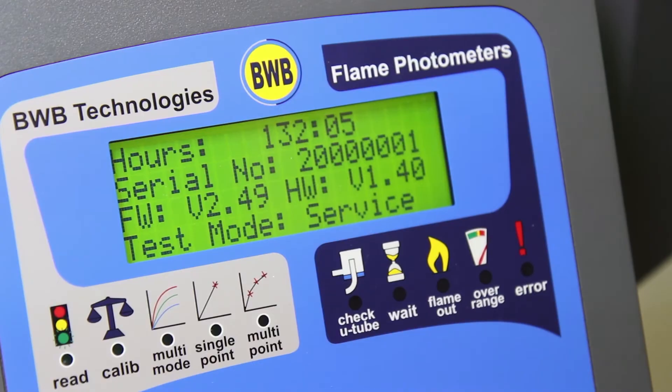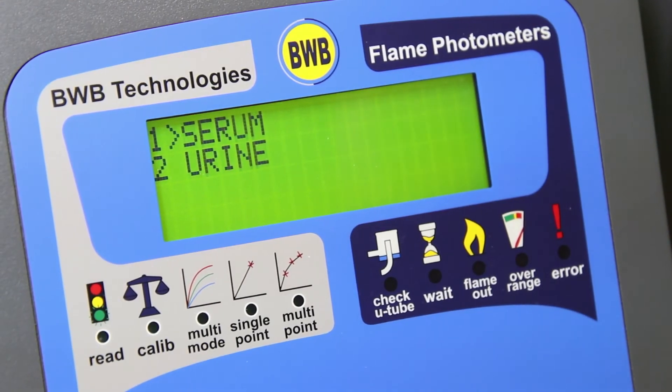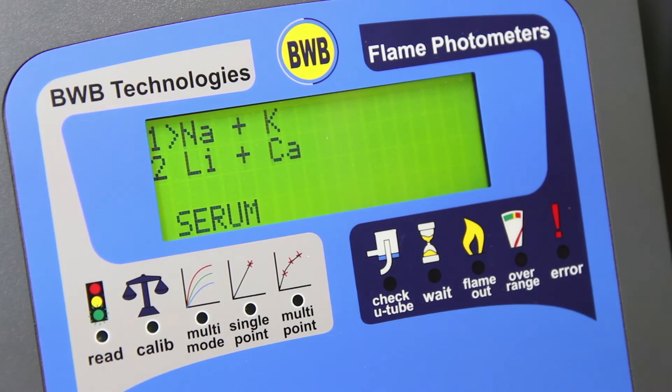Once you are in service mode, you are offered the option of testing for serum or urine. In this instance, we will select serum and sodium potassium ions.